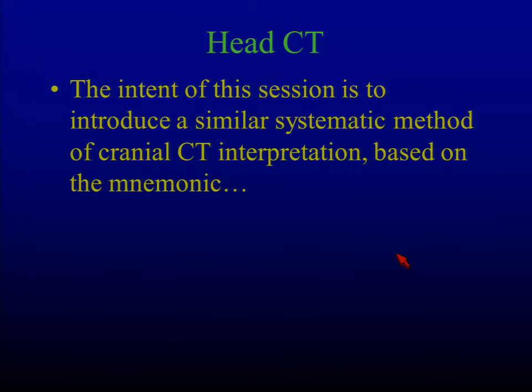I said, what is a way that I can have you go through a head CT and find all the life threats? You're not going to find everything. That's what neuroradiologists do. They go to neuroradiology school for years to figure that stuff out. And so I will miss a tectal plate lipoma, but nobody dies from a tectal plate lipoma.